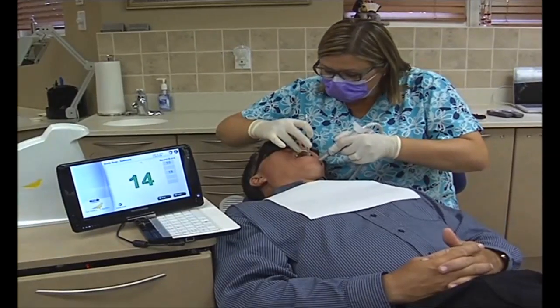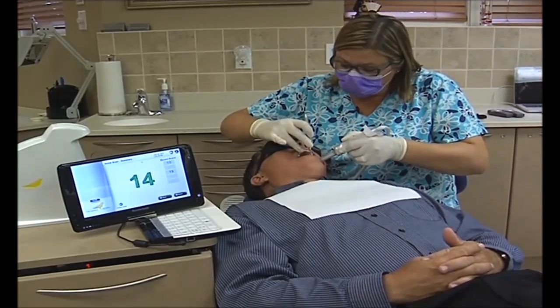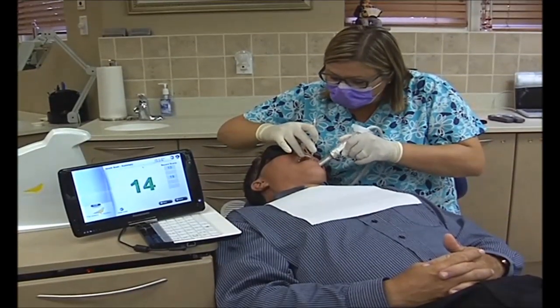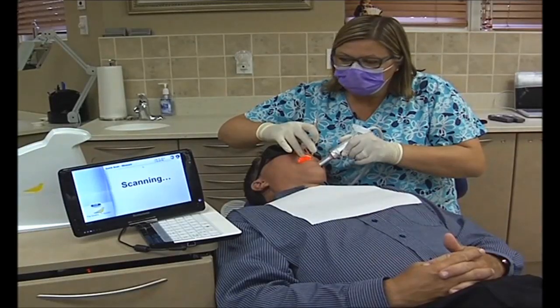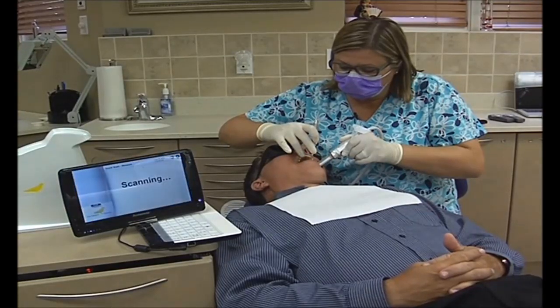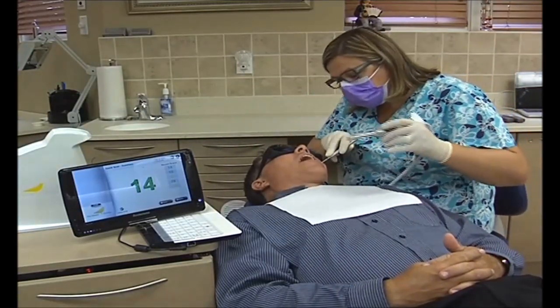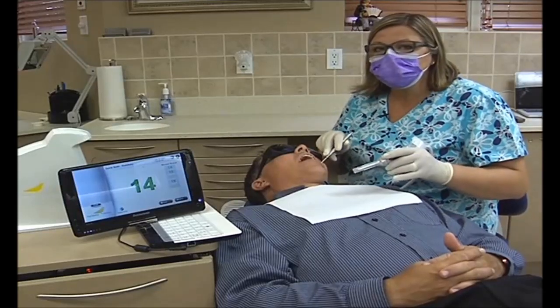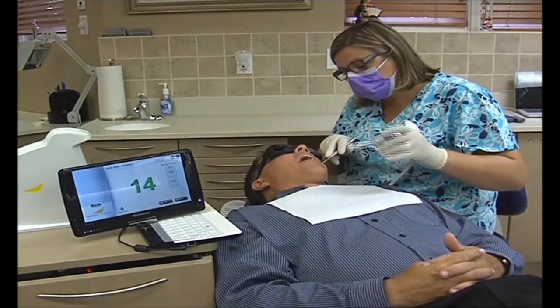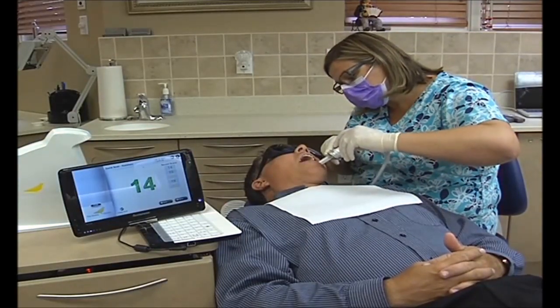Doug has a resin on the 2-6 — he has an M.O. and a D.O. I'm going to go right in between those two restorations to see if there's some breakdown in the margins. 14 — very healthy. Now I'm going to scan the 3-6. He has some gray shadowing on the 3-6, an occlusal amalgam, and on the distal lingual there's a dark shadow on the tooth. I just want to see if that shadowing is some amalgam leaching or is it actually some decay. When I'm aiming the beam into the tooth, I want to go into the area — not on the amalgam, but on the tooth structure.